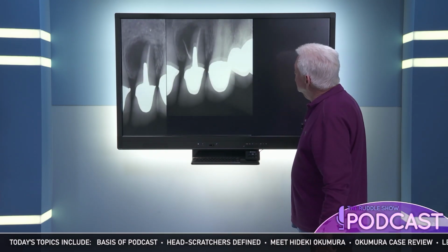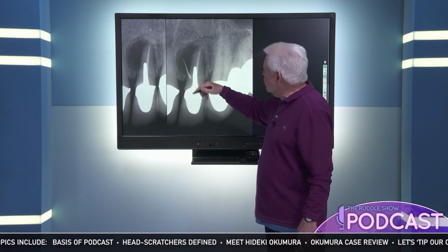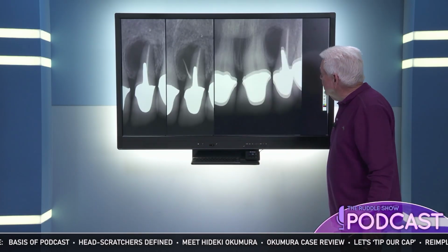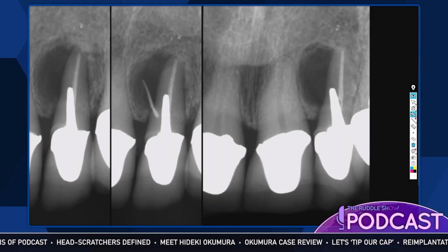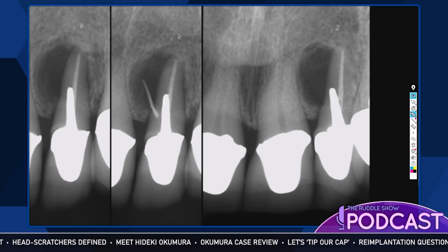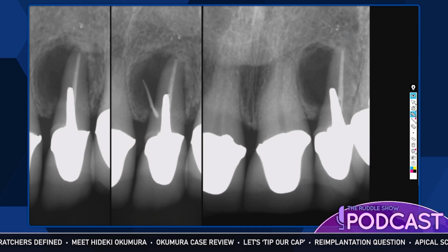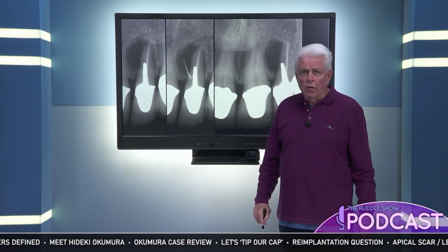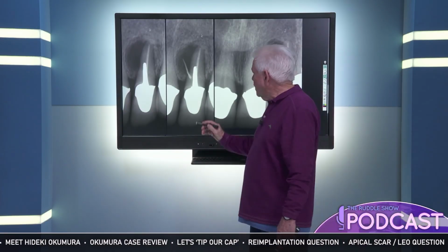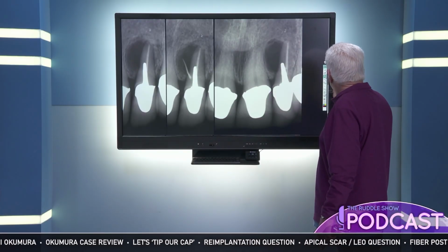We also traced the fistula. There was a long chronic problem, and so there was a sinus tract, and we traced it with gutta percha. But this is the other angle that I want you to get. So as you start to move the cone, what looks like maybe a little deviation is now a big deviation, and that suggests the etiology of the lesion on the lateral root is related to a perf, post-perf. So you can see the importance of angulation, can't you?